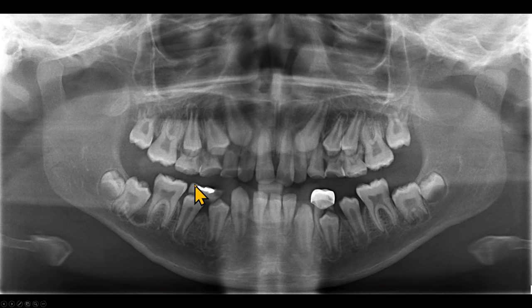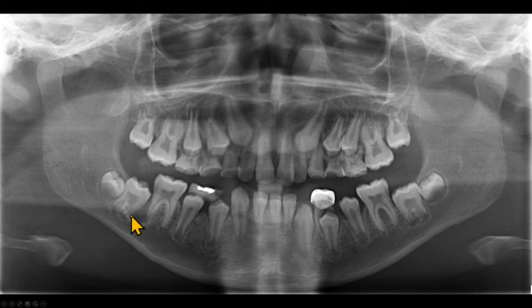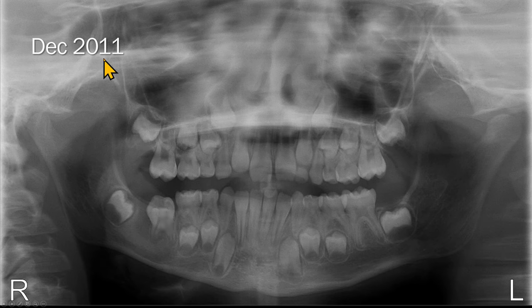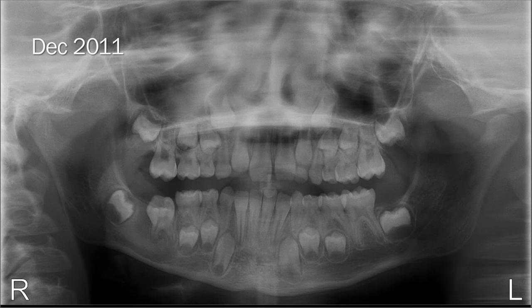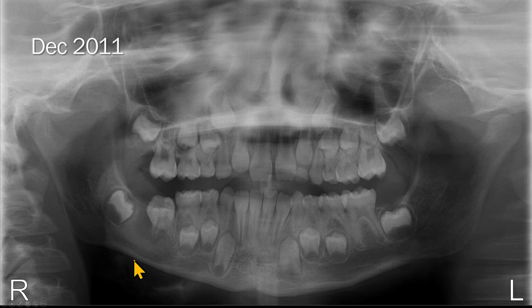This panoramic radiograph belongs to a child in mixed dentition. The buccal bifurcation cyst is a well-defined corticated radiolucency visible between the roots of the mandibular first and second molars on the right side. Compared to the left side, the right second molar appears a few millimeters distally displaced. On this panoramic radiograph acquired in December 2011, the eruption of the right first molar is delayed compared to the left; the crown of the first molar is tipped. There is a radiolucency surrounded by sclerotic bone, as frequently a buccal bifurcation cyst becomes infected.